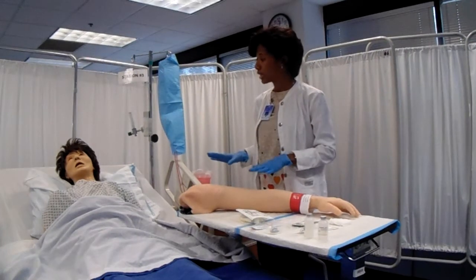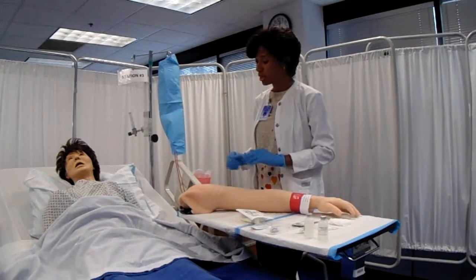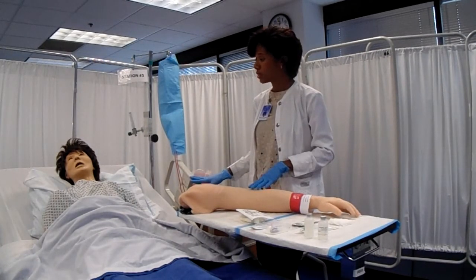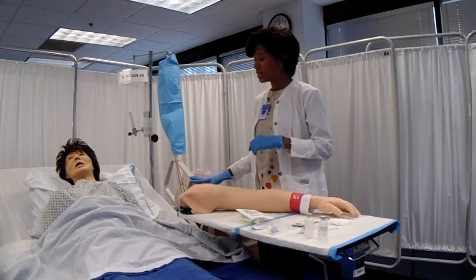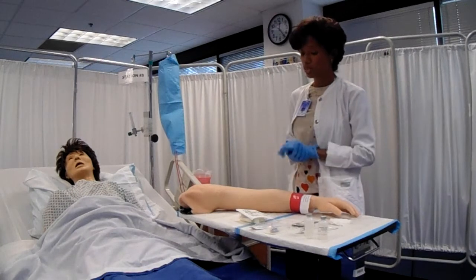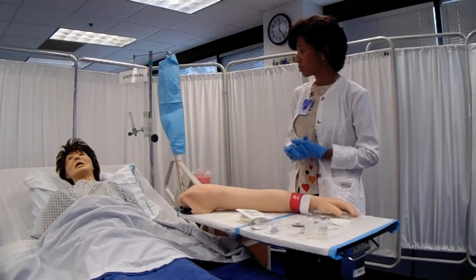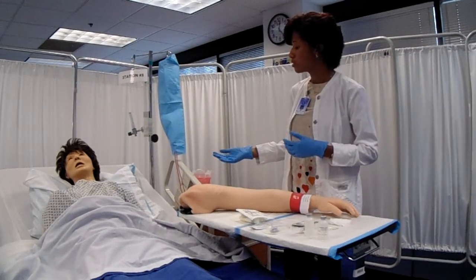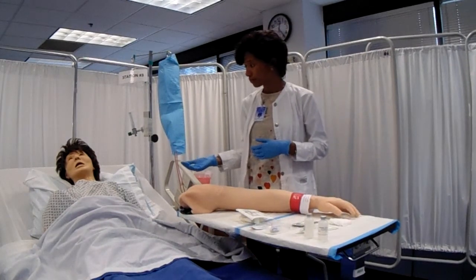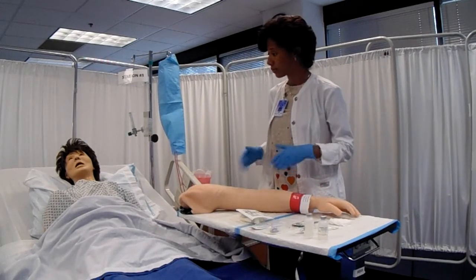It's within normal range because Lasix can lower that, so I checked to make sure that was good. And then also your blood pressure is within normal range, so Lasix, or furosemide, can also affect that, so I made sure that that was within normal range. All your other vitals are also within normal range. I just want to ask you, are you experiencing any pain? No, not at this time. And are you in a comfortable position?